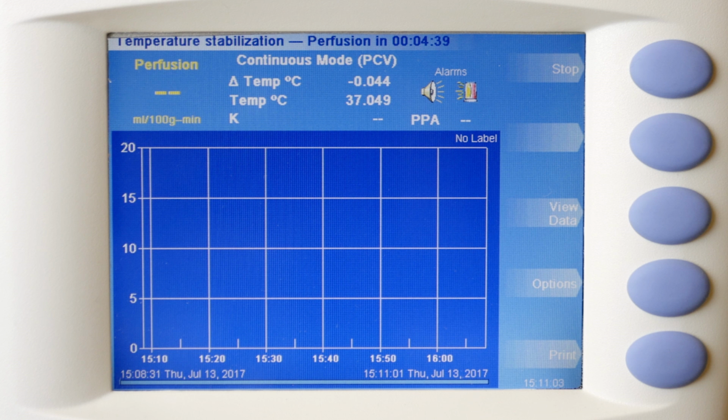The initial temperature stabilization phase enables the tissue and probe to approach equilibrium at baseline temperatures. This generally takes several minutes after probe insertion. Subsequent temperature stabilization phases enable the heated tissue to return to baseline temperatures and take 2 to 7 minutes depending on level of flow. Tissues with higher flows return to baseline temperatures at a faster rate.